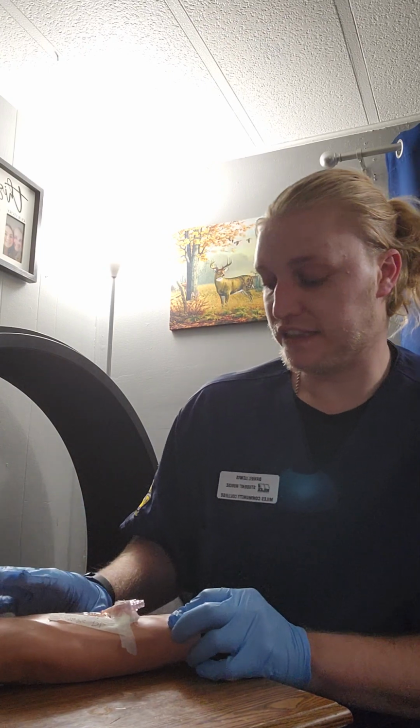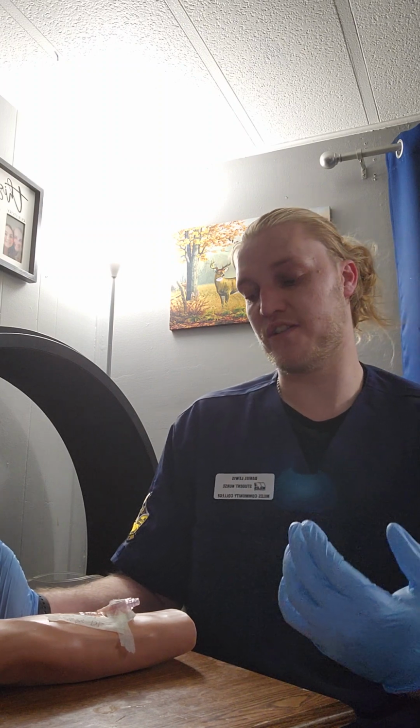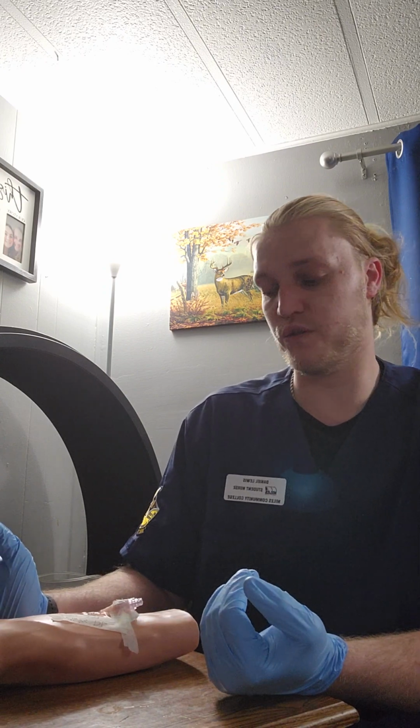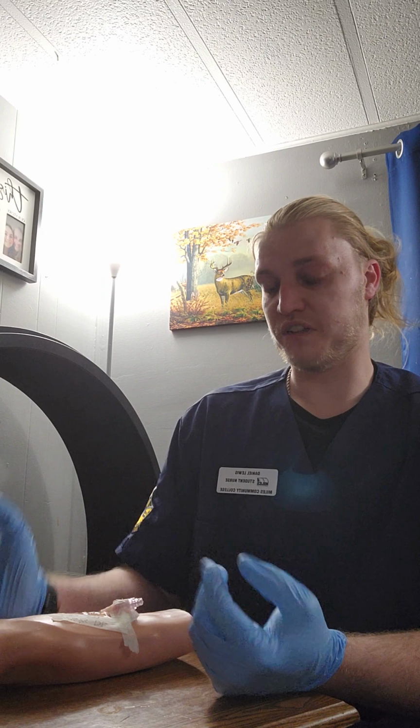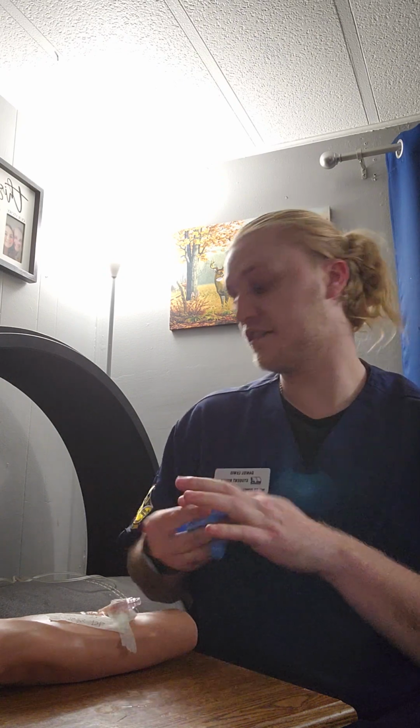Now that I have it saline locked, I would explain to the patient how to maintain a saline lock, making sure they're not pulling at it, hitting it, anything like that. The reason we're doing it is so that we can still continue to give medications if we need to. Once I'm all done with this, I would remove my gloves, take off everything, clean up my supplies, and then go document in the MAR that I discontinued the IV, did the patient education, all things like that.